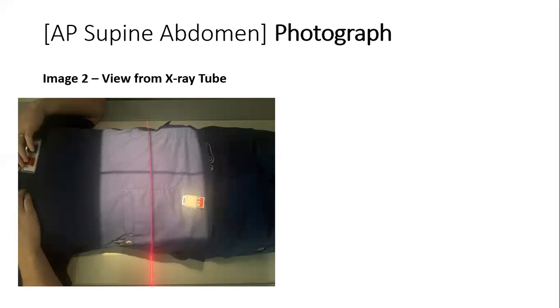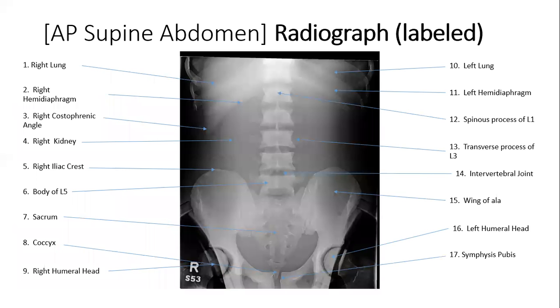The anatomy demonstrated in this image should be the outline of the liver, spleen, the kidneys, the psoas muscles, air-filled stomach and bowel segments, and the arc of the symphysis pubis for the urinary bladder region should all be demonstrated. The items of profile should include the symphysis pubis, the liver, and lower margins included as well in the image.